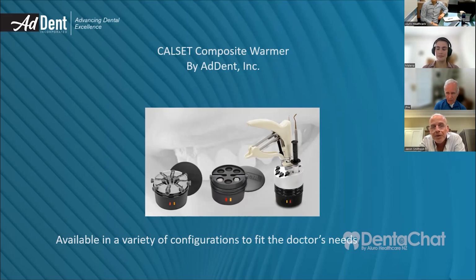So if you want something flowable, my go-to is either to use a flowable but accept the disadvantages you've got there, or to heat a packable composite, and then I get flowable manipulation advantages, but I also get packable aesthetic advantages and also mechanical advantages.